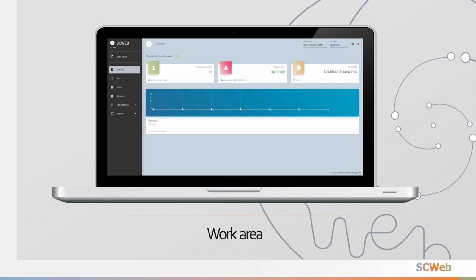As we have already brought up in the blood collection presentation, SCWeb system allows every organisation and every work group to be managed by work area and assigned process. If for blood collection, the work areas are the collection chairs, for blood processing, the work areas are the conservation and packaging areas and the processing procedures, such as centrifugation, shock freezer, fractionation, viral inactivation, and filtration.